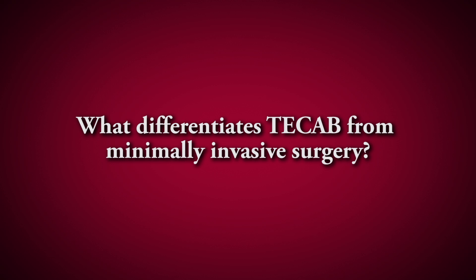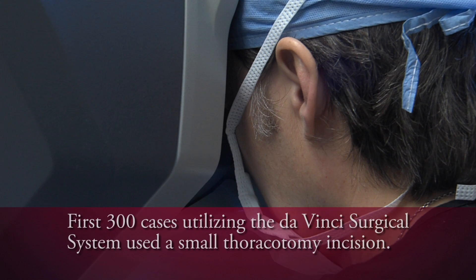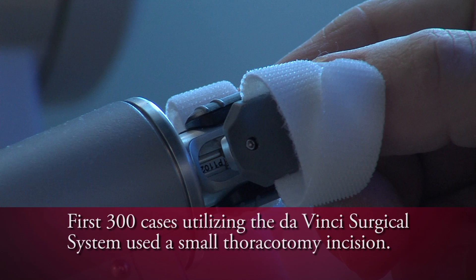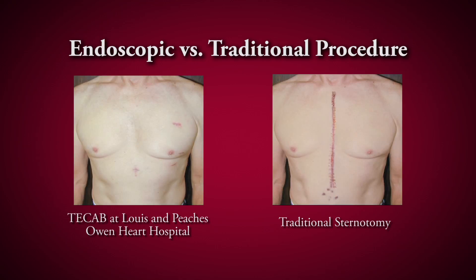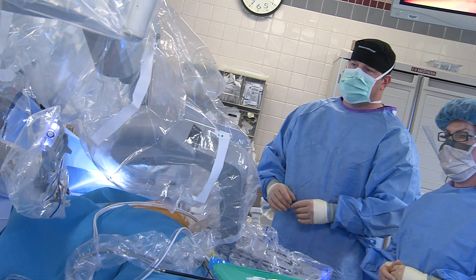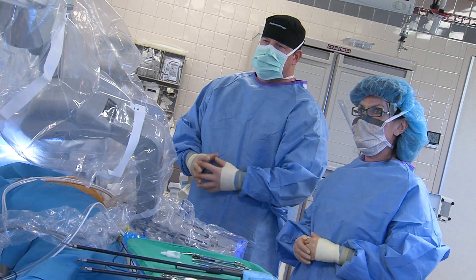When we started using the Intuitive DaVinci robot, our first 300 cases were completed by way of a small thoracotomy on the left side of the chest. For the past two years, we've eliminated the small thoracotomy and we now offer a completely endoscopic operation — very much like the general surgeons do with a Band-Aid cholecystectomy, or the orthopedic surgeons do with arthroscopy of the knee. We can now apply that technology to coronary bypass grafting with the use of the Intuitive DaVinci robot.